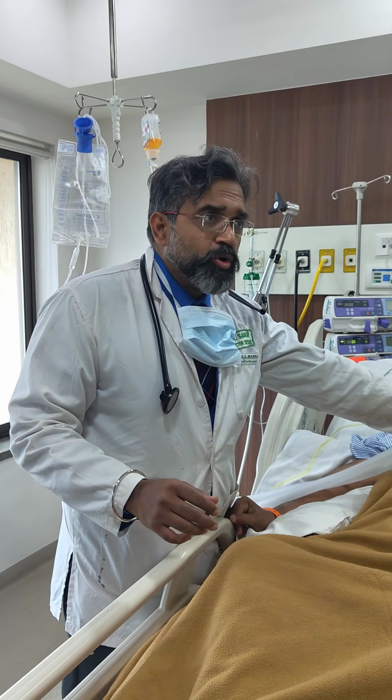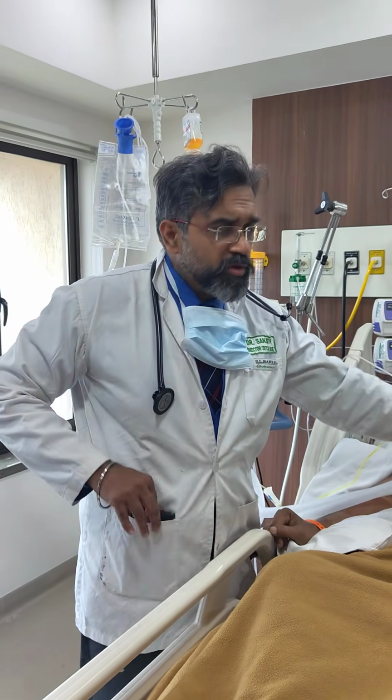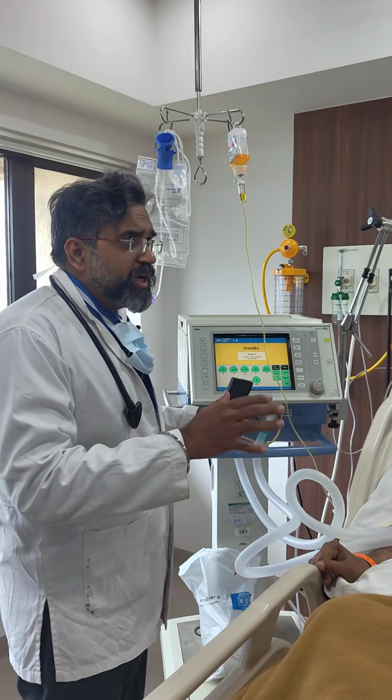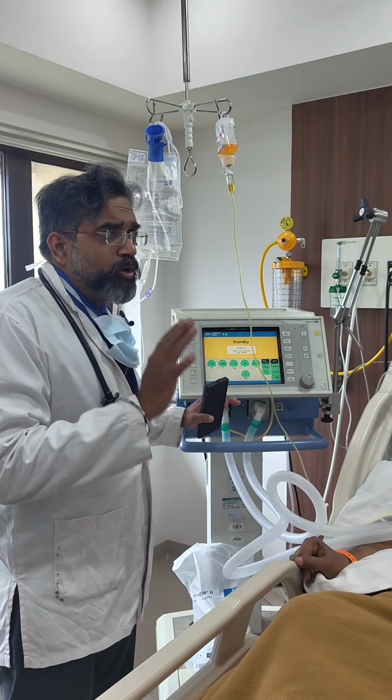Pressure support? No, you never apply pressure support. You have to take care of the patient. So for that matter, the only mode that will give complete rest is volume control mode.